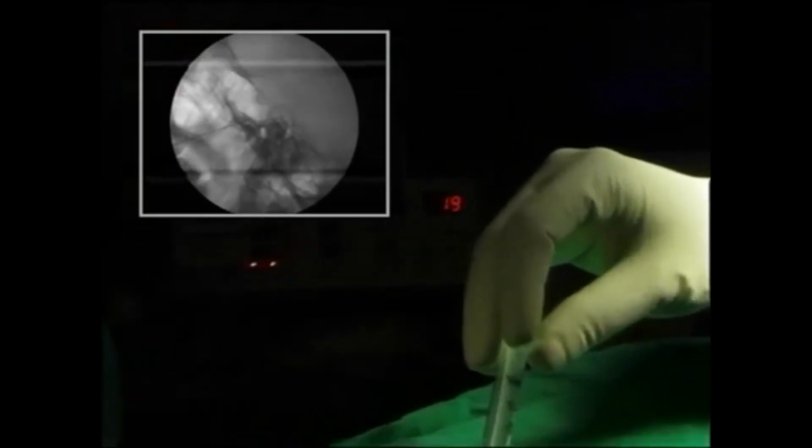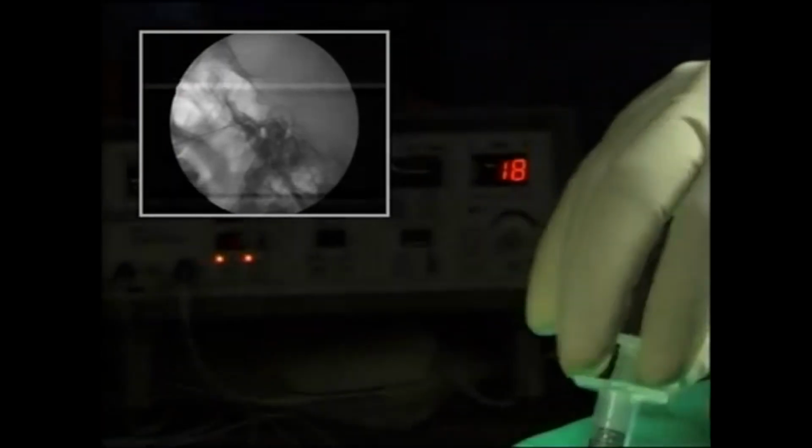So I'm going to do a negative aspiration again, and then I'm going to do my RF ablation. You can give some more fentanyl. Who was asking for fentanyl? So motor stimulation is negative.